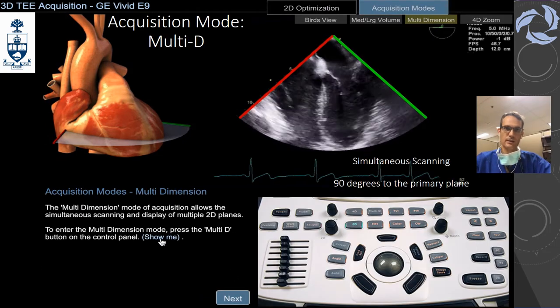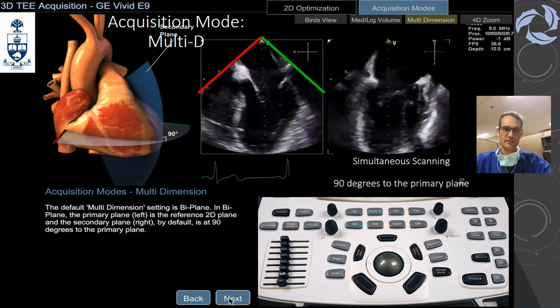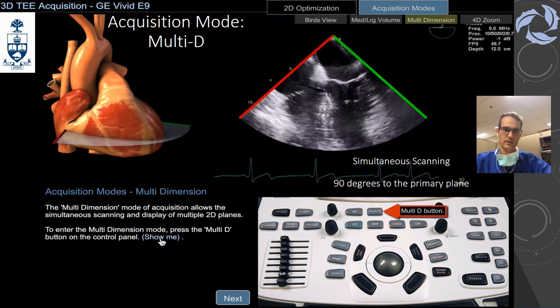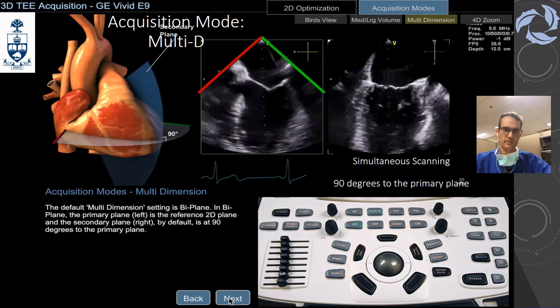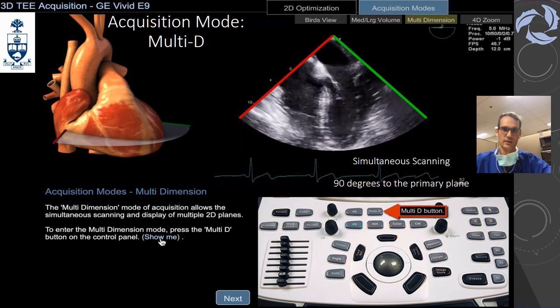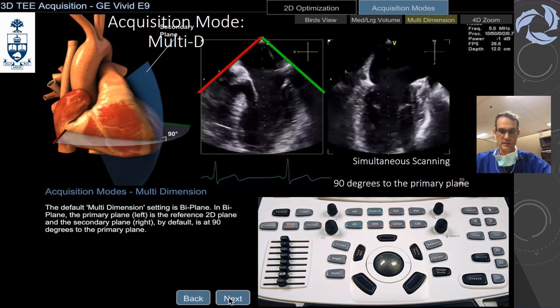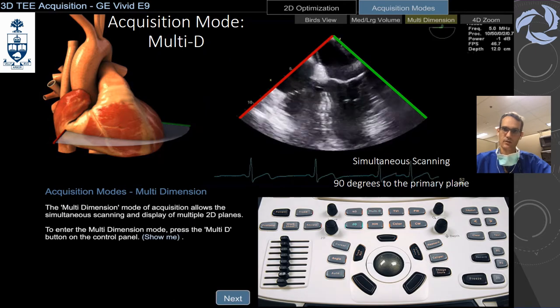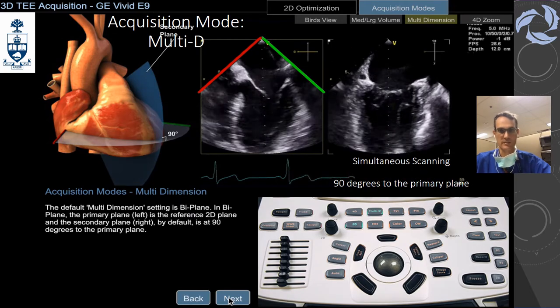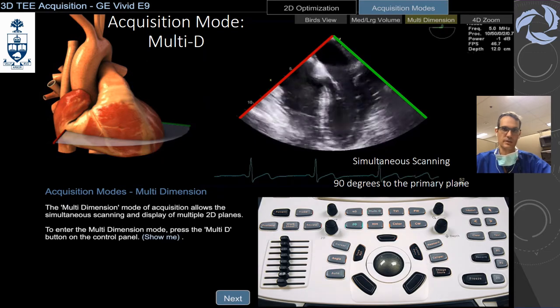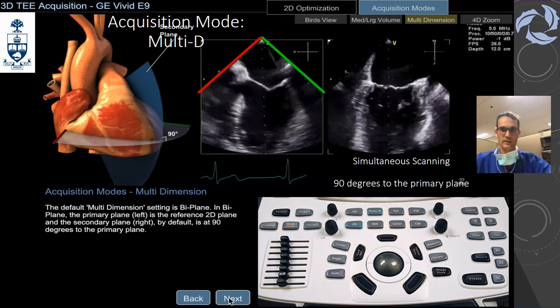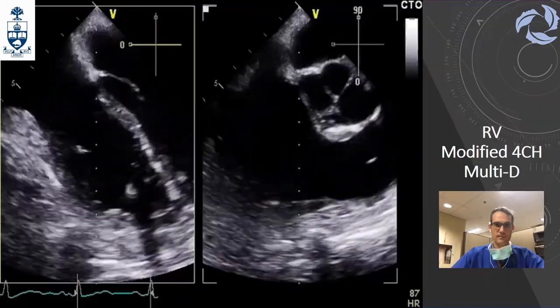The first mode on the GE is called MultiD, which is the equivalent of X-Plane on Philips. From the 4-chamber view you get 90 degrees — anterior and inferior walls are shown simultaneously. This is ideally recommended for catheter placement guidance, or to see both views of the left ventricle, mitral valve, or aortic valve simultaneously. Most of this technology is used for advancing catheters and MitraClips. Those are examples of MultiD of the right ventricle using the GE machine.